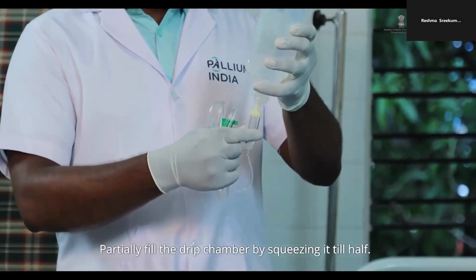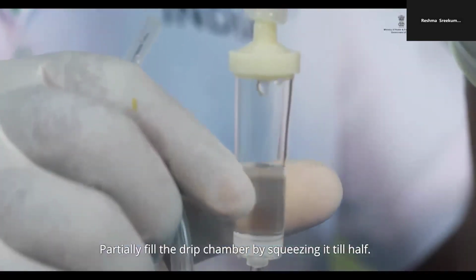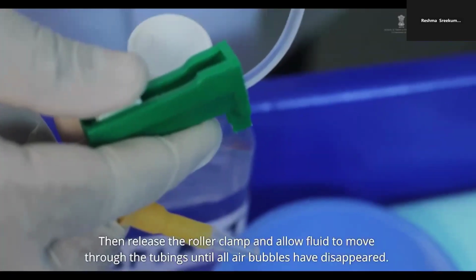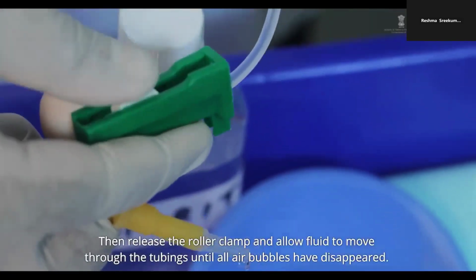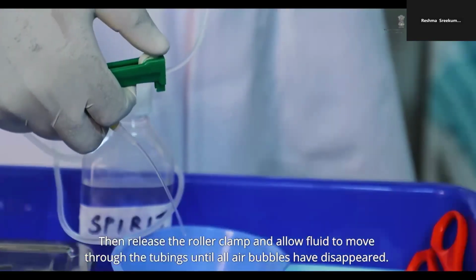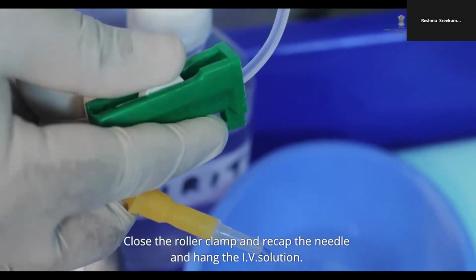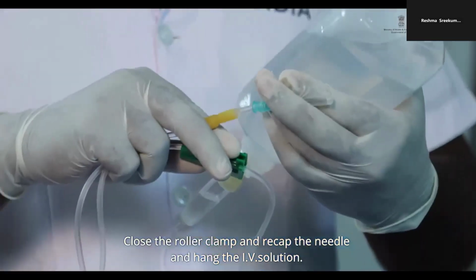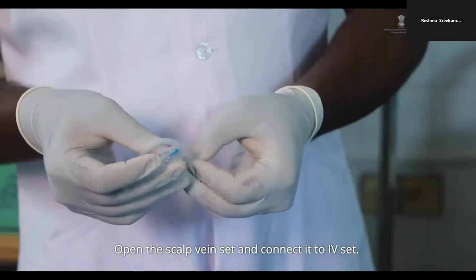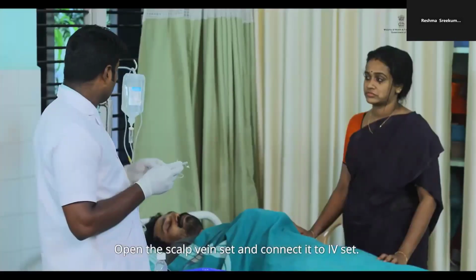Partially fill the drip chamber by squeezing it till half. Remove the needle of the IV set. Then release the roller clamp and allow the fluid to move through the tubing until all air bubbles have disappeared. Close the roller clamp, recap the needle and hang the IV solution. Open the scalp vein set and connect it to the IV set.